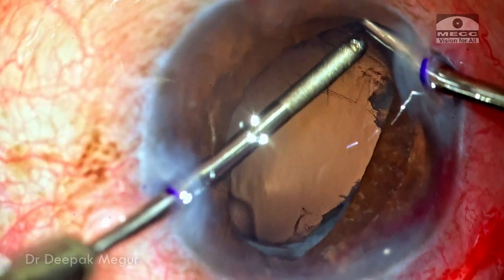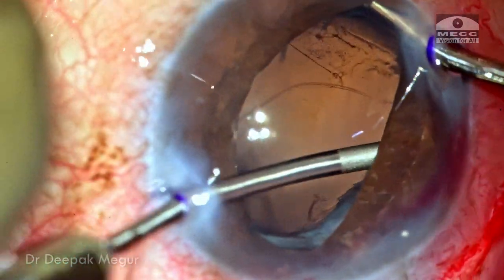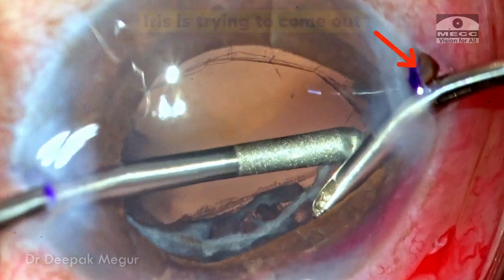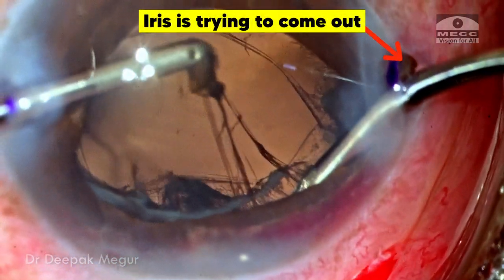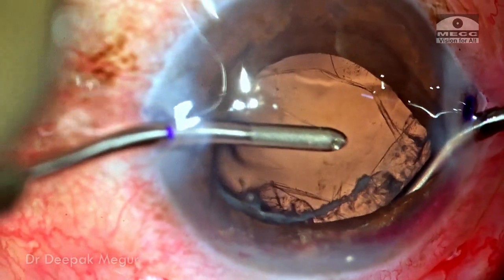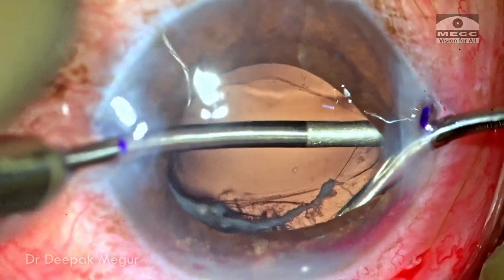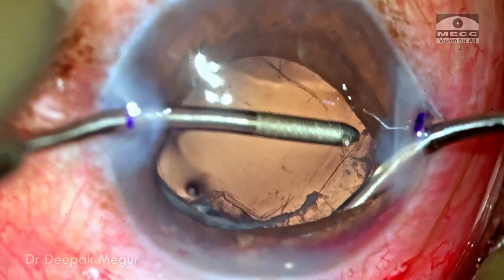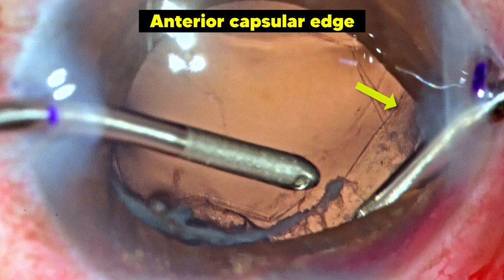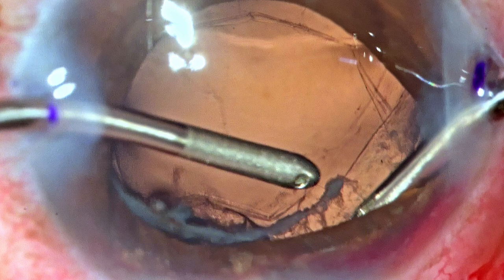This lens matter is actually sequestered between the posterior capsule and the anterior capsule leaflets. Gently but surely, most of the lens matter is aspirated out. Because the side port on my right coincides with the original side port incision, the wound has opened up and the iris is trying to prolapse out. Nevertheless, very carefully and patiently, most of the cortex sequestered in the capsular fornix is being aspirated out. I can now clearly visualize the edge of the anterior capsule — the posterior capsular tear in the superior quadrant is way down in the periphery, and what I'm seeing is actually the anterior capsule.